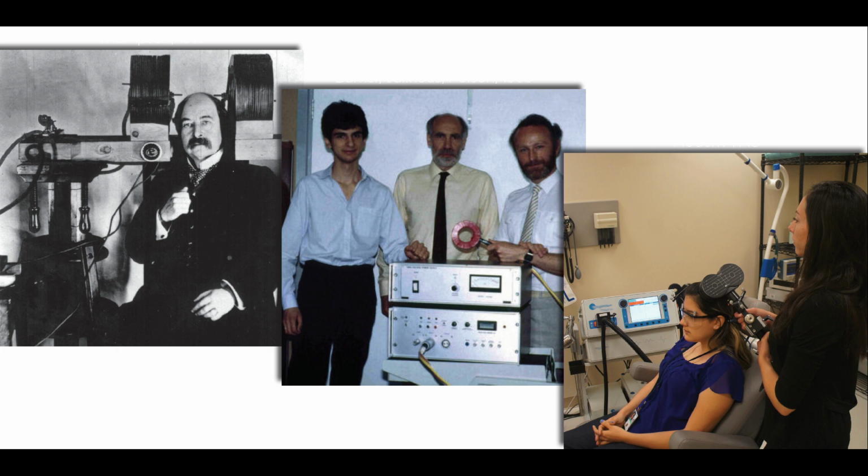Now, TMS is not exactly a modern technique. We saw earlier versions of this technology already in 1910 by Thomson, illustrated on the very left. Now, the Thomson device was a very huge magnetic coil that is placed on both sides of his head. It wasn't very practical. It wasn't very portable.